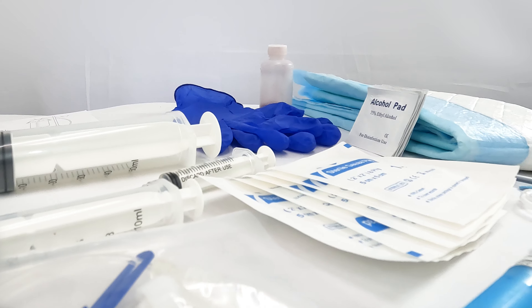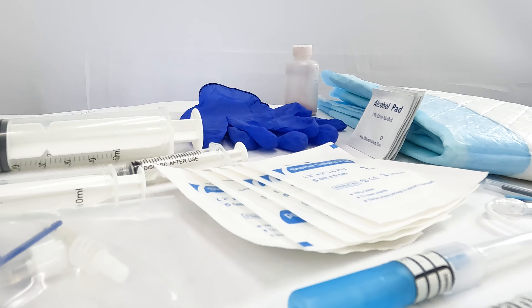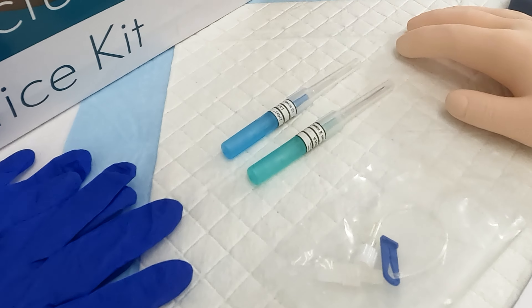The simulator includes a variety of needles, syringes, and catheters to draw blood and insert catheters. Note: to ensure the longevity of the arm's skin, do not use needles larger than what is included with the kit.